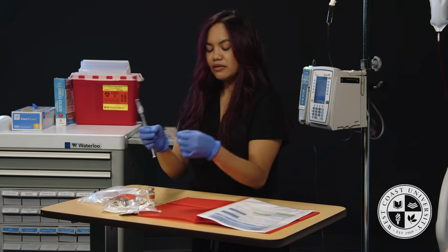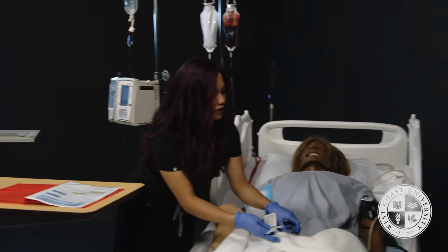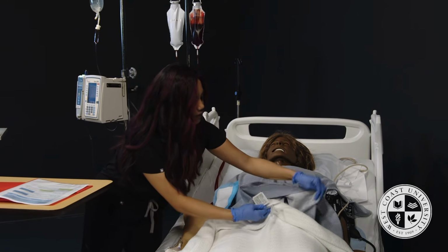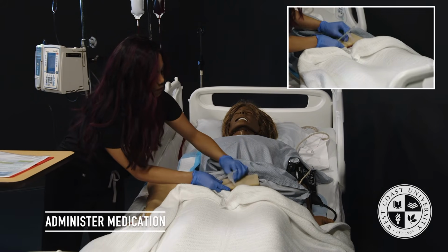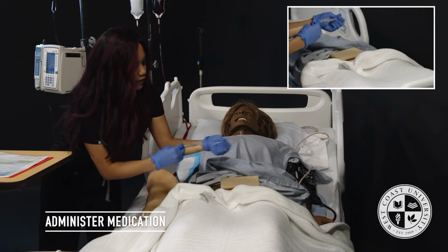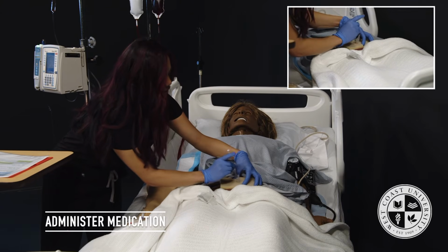So I'm going to go ahead and grab my alcohol pad. All right, Mrs. Cruz, you're going to feel a little poke into your abdomen, okay? I'm going to go ahead, lift up the gown. Go ahead and scrub for at least 20 to 30 seconds. Allow it to air dry. I see that it has now air dried. So I'm going to go ahead. I'm going to give you a little pinch, okay? A little poke.